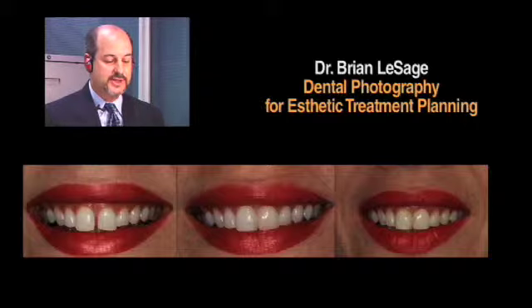And so I have a plan. Next time when they come back, usually I schedule them for half an hour on the return visit. I know that I'm going to add a little bit of composite here. And that's really all I did to this case to correct the axial inclination.